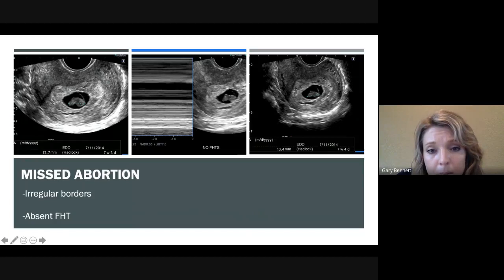They did do an M mode. Again, I see no problem using a pulse wave if you're more comfortable with that, especially in the case of a fetal demise. And we can see again on that third one.